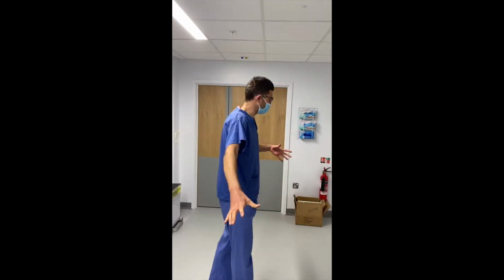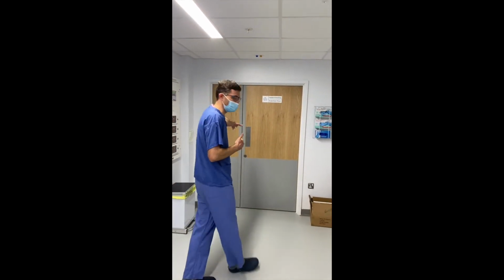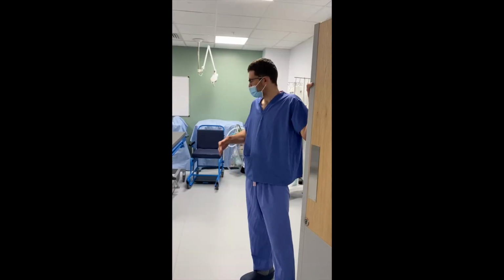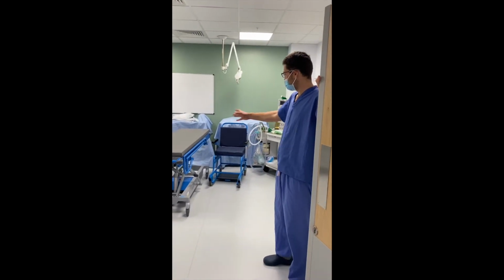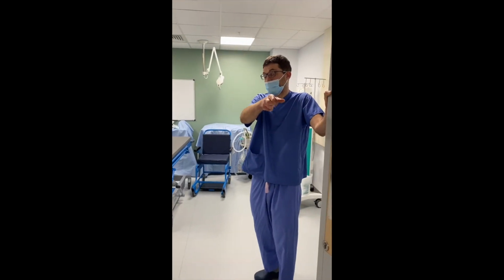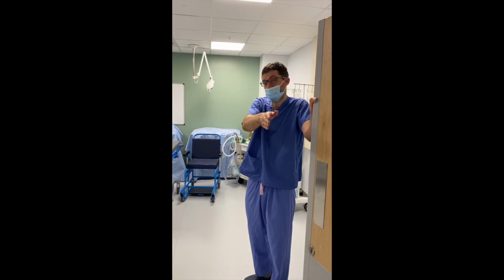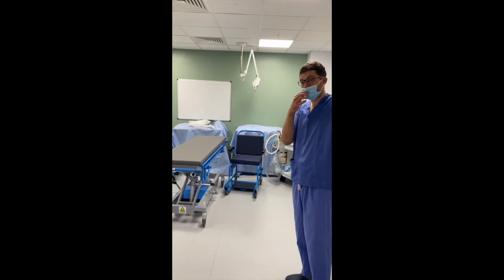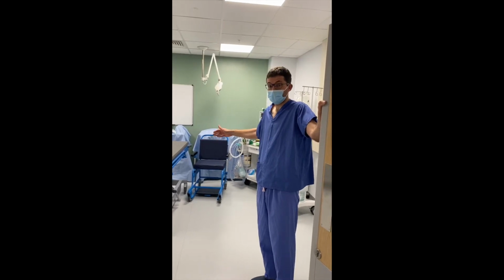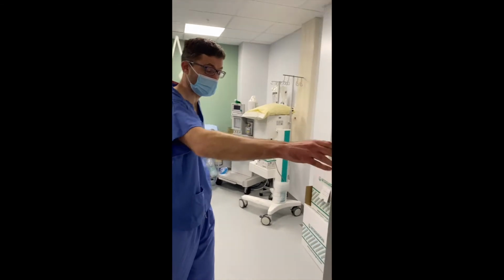So once you've brought the patient in here, you'll then move through to the anaesthetic room, which is in here. So once you bring the patient in here into the anaesthetic room, this trolley won't be in here, but the radiographers will bring the table, which is attached to the MRI scanner, from the MRI scanner into here, and the patient will be transferred onto the MRI table in here. You'll also attach the MRI compatible monitoring.